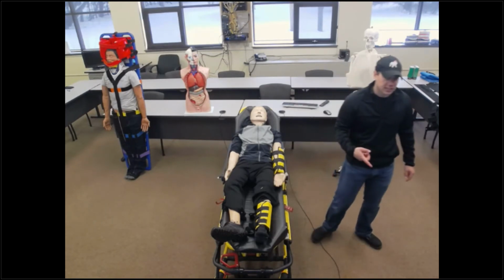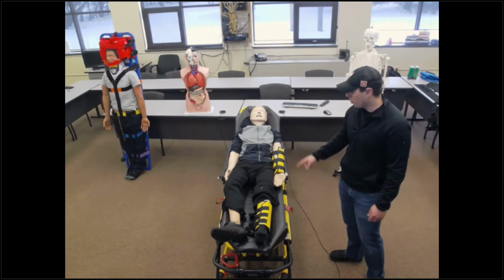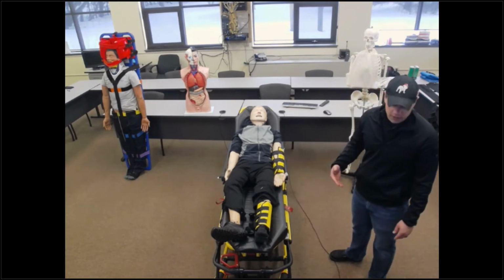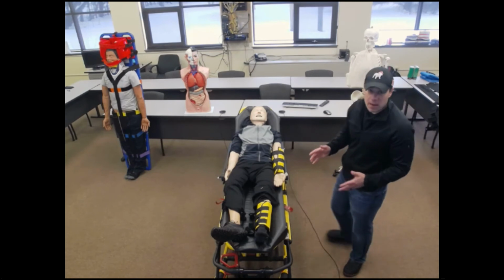Now I'm going to reassess my pain evaluation. So let's say the patient was complaining of pain at an 8 out of 10, both the ankle and the wrist. Then I'm going to go ahead and ask them what their pain value is now that we went ahead and applied those splints. With any splinting application, don't forget about pain management.